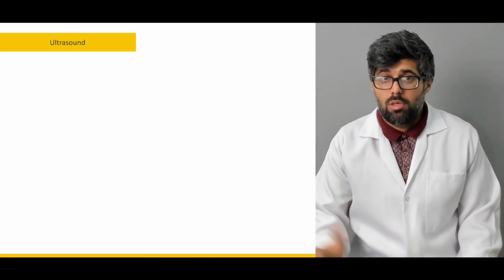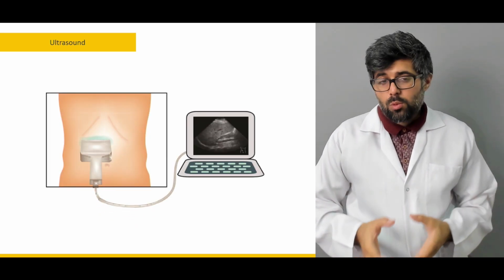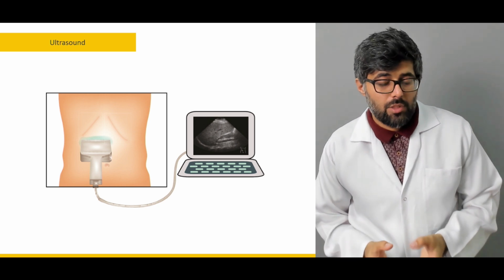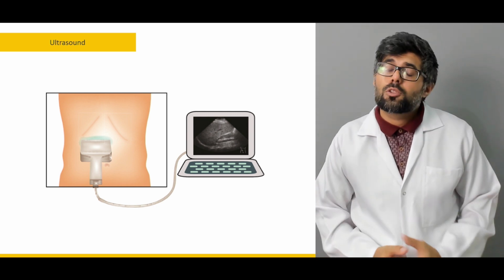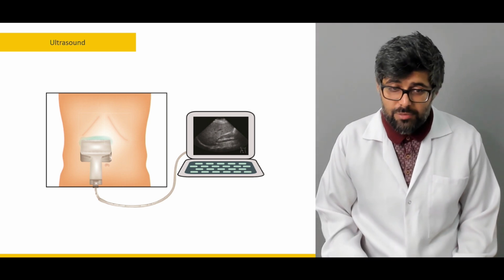Next one is the ultrasound or the ultrasonography. Now, ultrasound works on the principle of sound waves. It does not rely on radiation, either ionizing or non-ionizing. It works on the principle of ultrasonic sound waves.